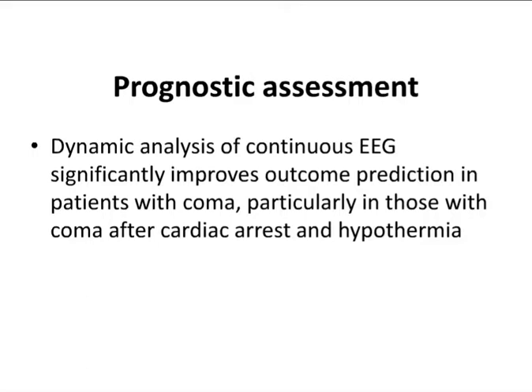But actually with EEG, we recently went into a more dynamic approach where you see the response of the activity after, for example, a painful stimulation, or you see trends of activity over time.